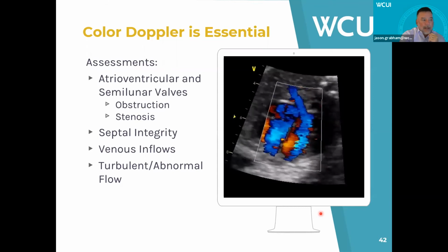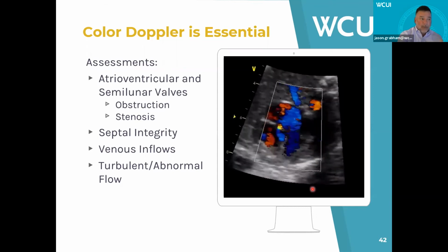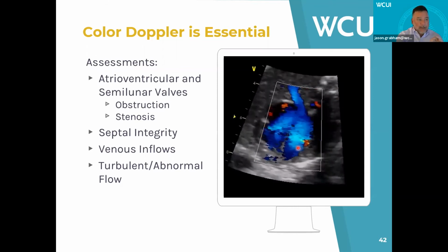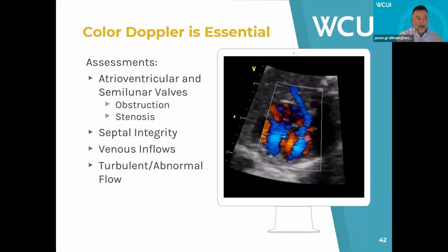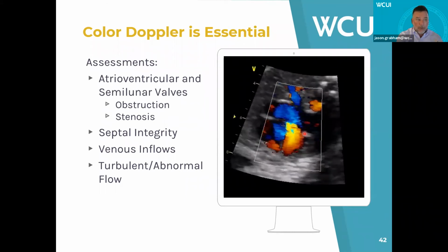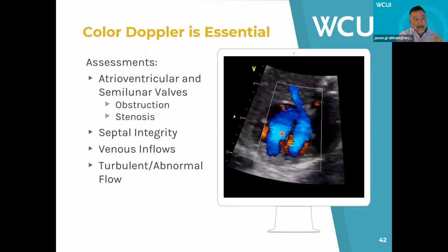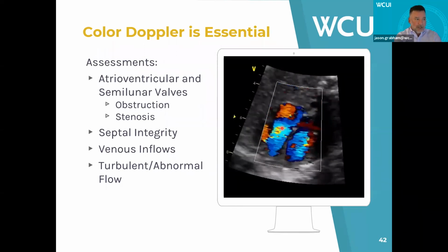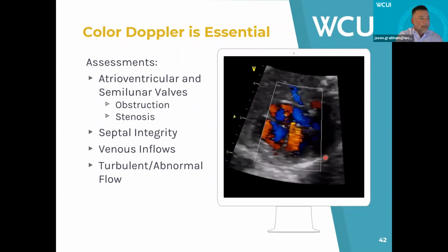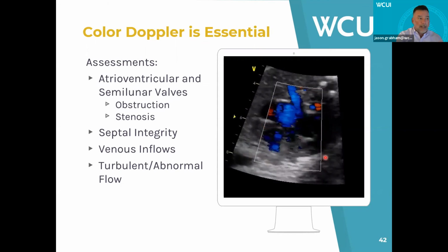And the thing I would add here too is the value of the cine loop, because I may be scanning, I may be assessing in this image for atrioventricular valve regurgitation. I may be looking at inflow. Does it look laminar and smooth? Both the mitral and tricuspid look great. There is a tiny, tiny, tiny whiff. If you squint your eyes just right, you'll see just a trace of tricuspid valve insufficiency. Depending on what you're scanning this patient for, that may or may not be of any real consequence.